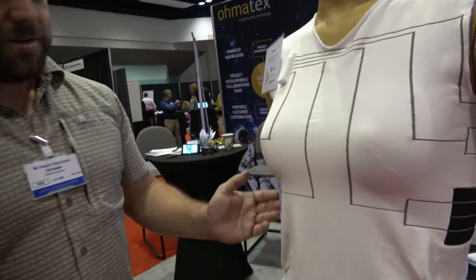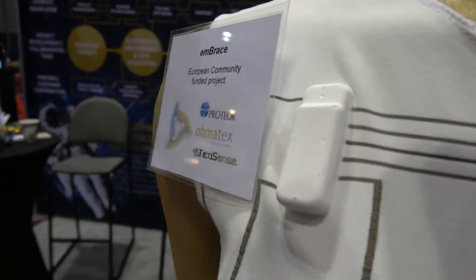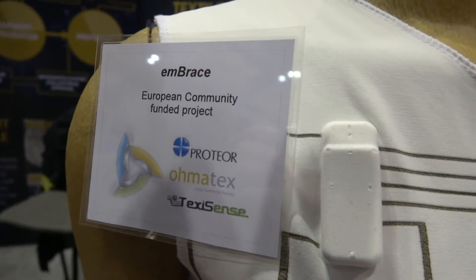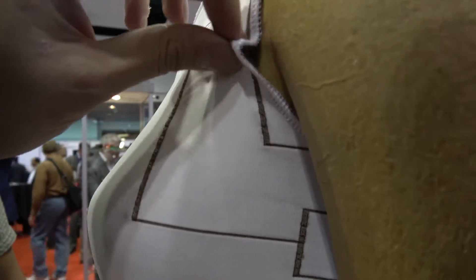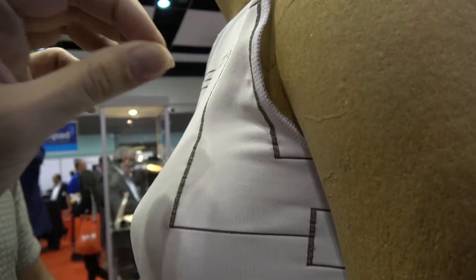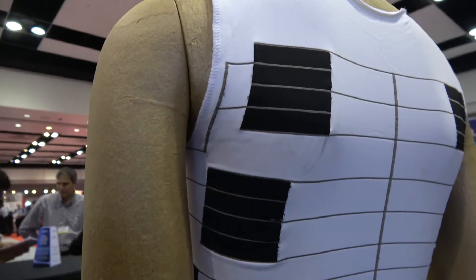At Omatex you do all kinds of wearable technologies. Here we're looking at a t-shirt with pressure sensors. It's a European community funded project — we have three companies together: Textsense, which makes the yarns and has the technology for the pressure sensors, and a partner making the brace for scoliosis, and Omatex who does the integration on the t-shirt.